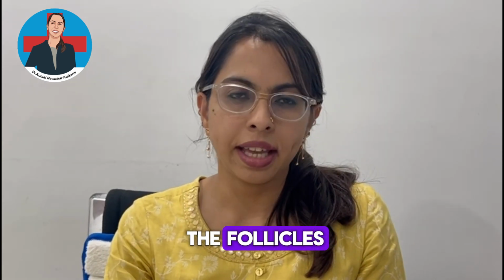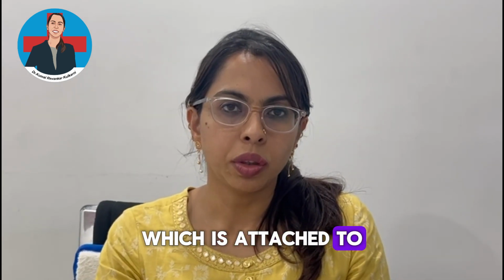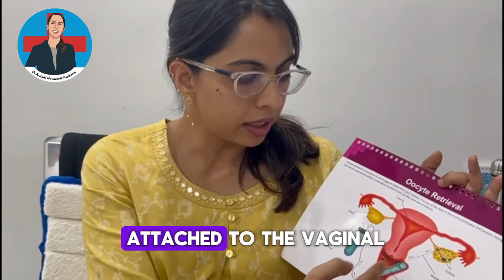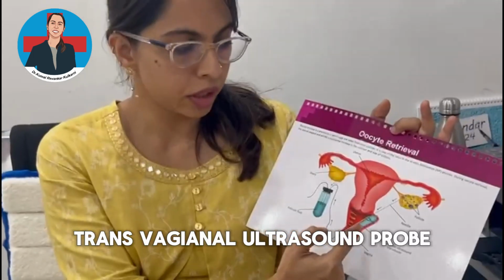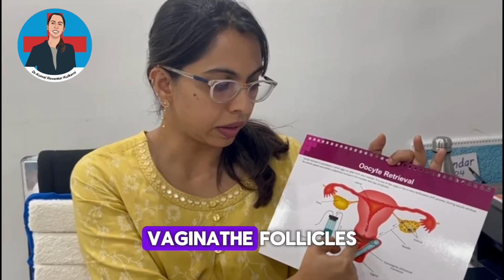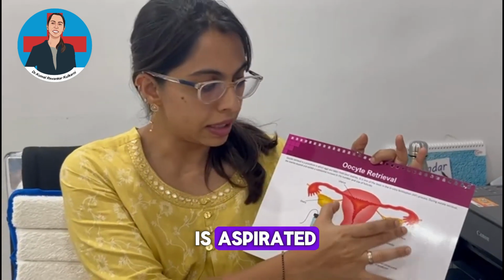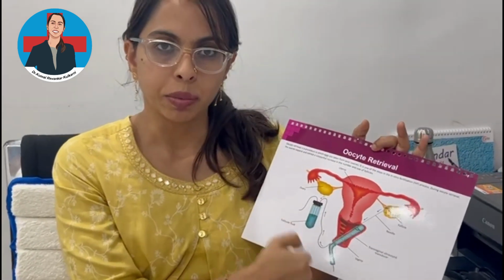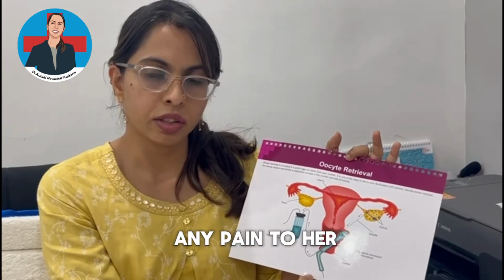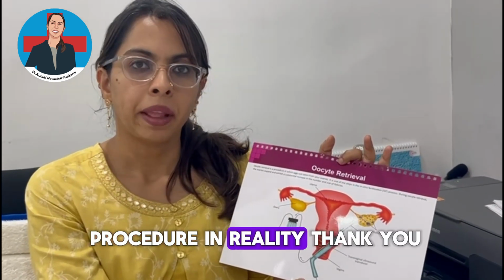All the fluid which is there in the follicles is aspirated with the help of a needle which is attached to the transvaginal ultrasound probe. As you can see in this image, a long needle is attached to the transvaginal ultrasound probe, and that pierces the vagina to reach the ovaries, and all the fluid in the follicles is aspirated and collected in the tube. So it's a daycare procedure, and since the woman is under anesthesia, it does not cause any pain to her. Now let's see how we go about this procedure in reality.